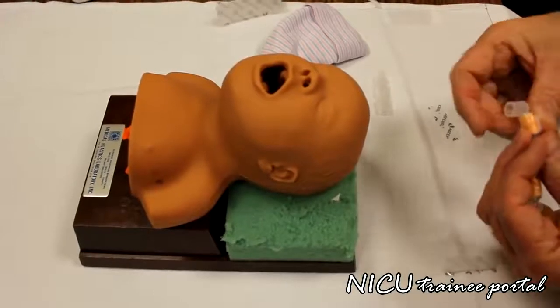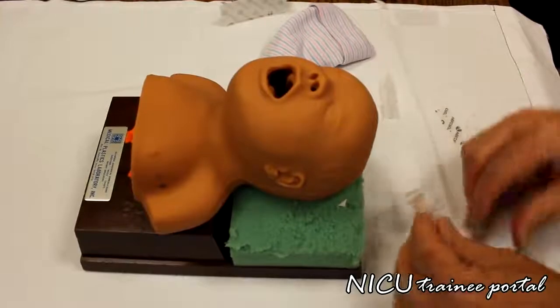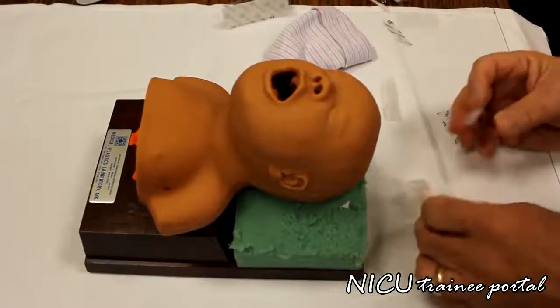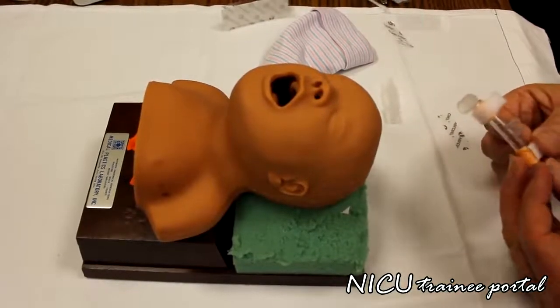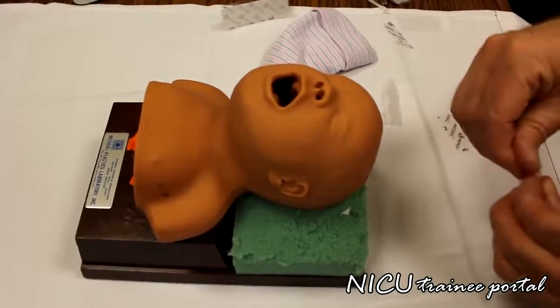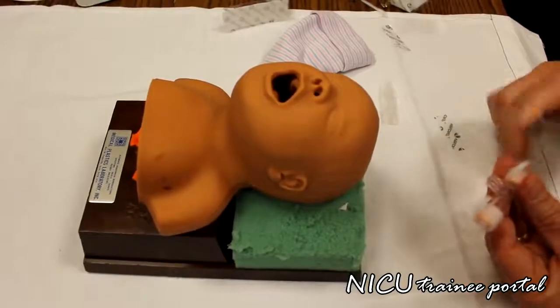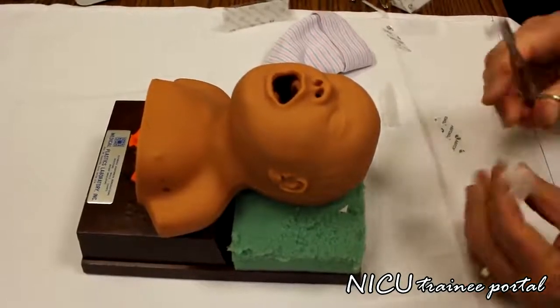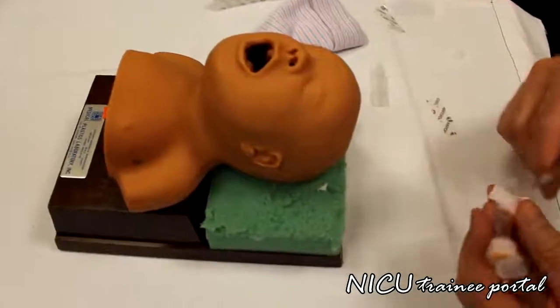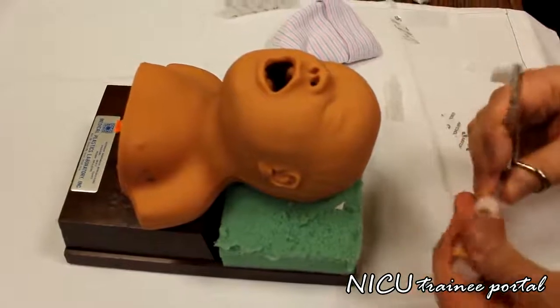And then we put it on and wrap it around. Nice and tight. Same on the other side, in the same position, again lined up with the prongs. And then we take the scissors and we just trim off the excess. Okay, nice and neat.